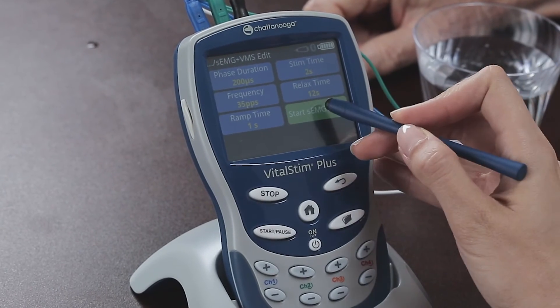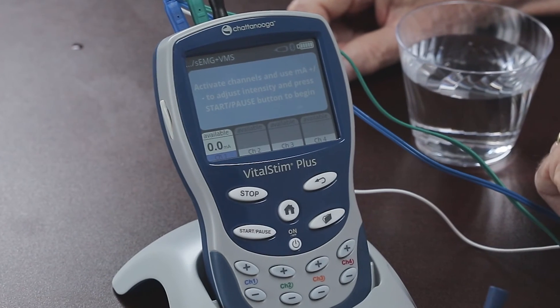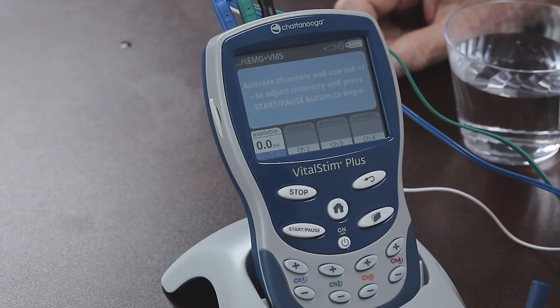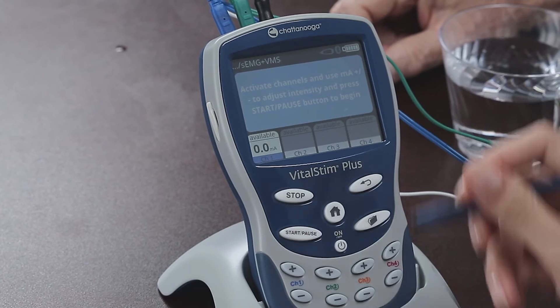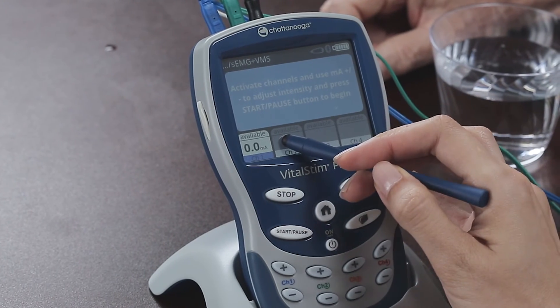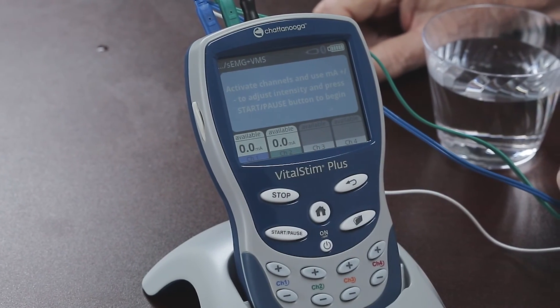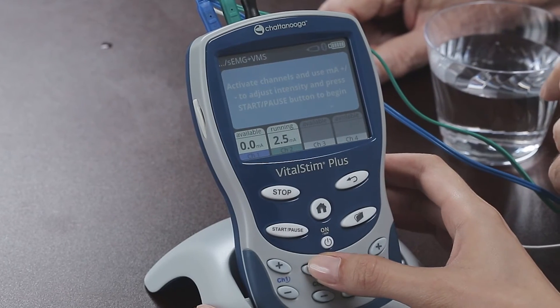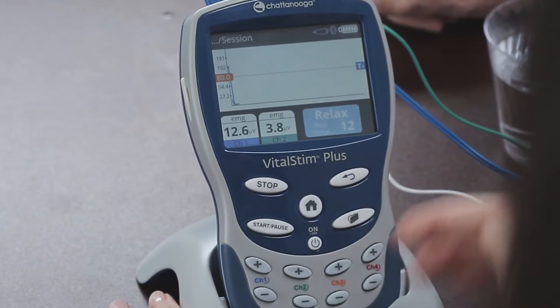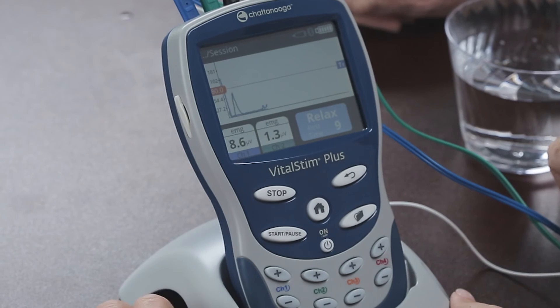We're ready to go. Press the Start Surface EMG plus VMS button to bring up this screen. Channel 1 is already active and will remain active because it is the triggering channel, but in this example we are not going to stimulate through it, so we'll leave the intensity at 0 mA. We select channel 2 in order to increase the therapeutic intensity. Once we are at the right level, press start/pause and the machine will start in relax mode.